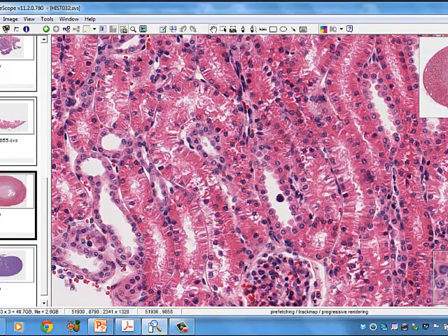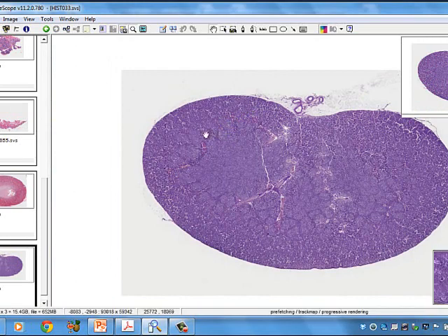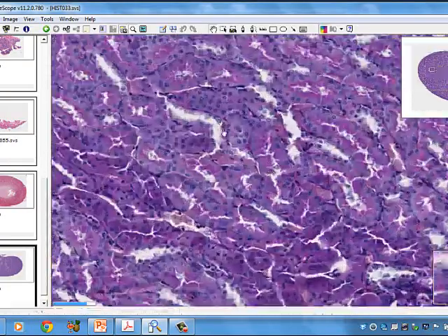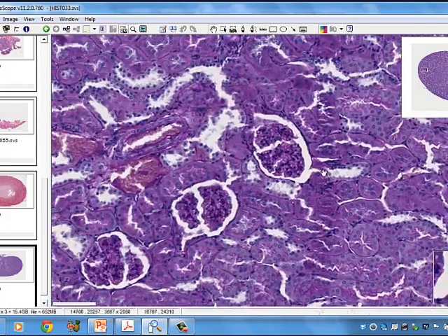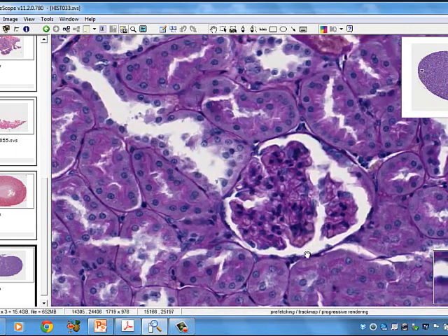And so if we take a look at that, we can see this is another kidney, and this is the cortex through here, and the upper part of the medulla. We don't see where the urine empties into the renal pelvis in this case. So if we look again, we can see just what we saw before, and in the cortex you will be able to see glomeruli. So we see this is a renal corpuscle, and these are capillaries in through there.